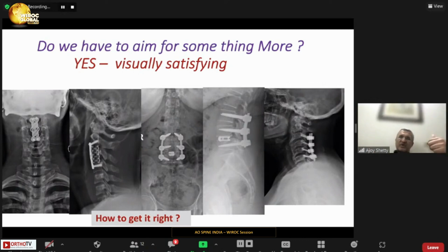And the second way of identifying the midpoint is to feel the suprasternal notch and be sure that you are in line with it. That corresponds to an anatomical midpoint. Third way, the majority of the systems have temporary pins which can be placed, to verify that you have placed the plate exactly in the center.